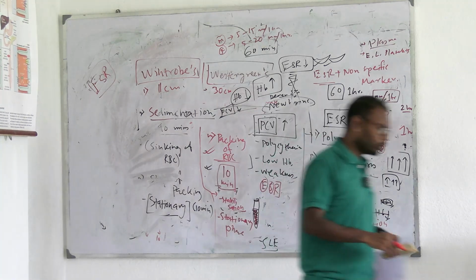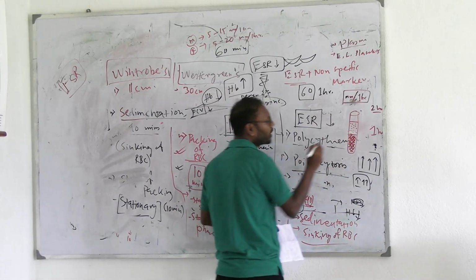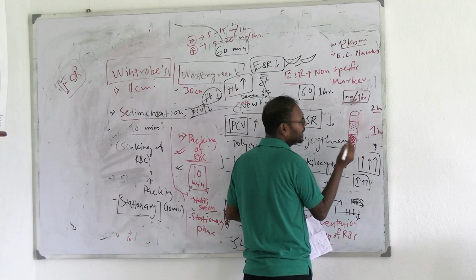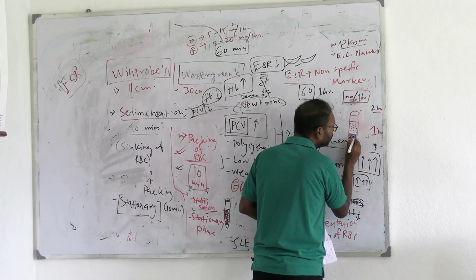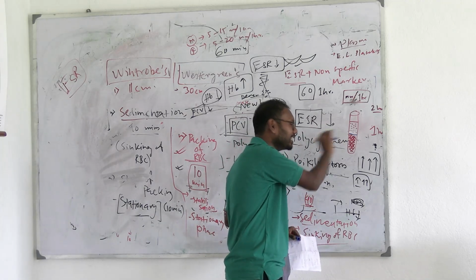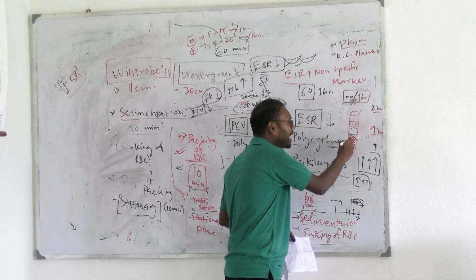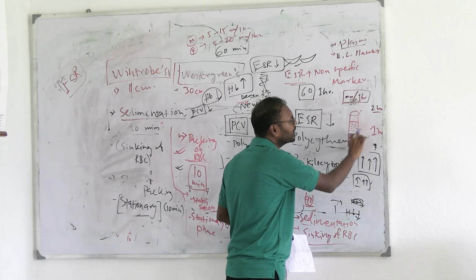If you look closely, these RBCs take up most of the space in this test tube. The WBC and platelets only contain about this amount. I am not kidding, it is even less than that. Among all these packed cells, the RBCs are taking up all these spaces.